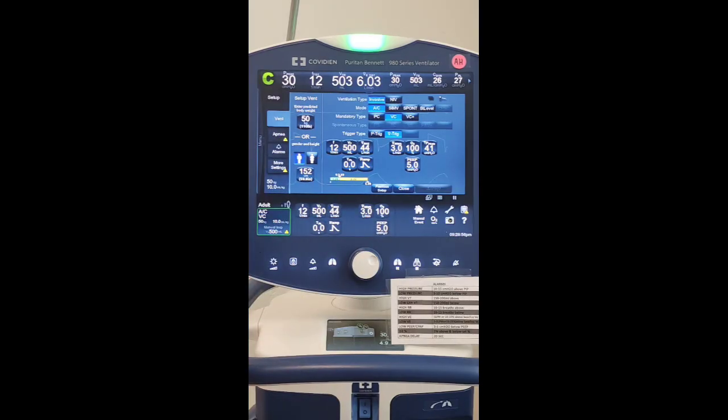Okay, and what we're going to do is switch this patient over to pressure control. Just remember that we're here in the lab, we have a test lung. The test lung is not doing anything other than being a normal test lung. So normally, if we have a patient who is on ACVC, and now we're beginning to see the peak inspiratory pressures rise and also plateau.